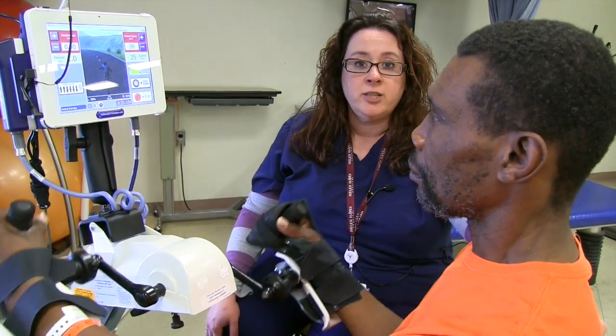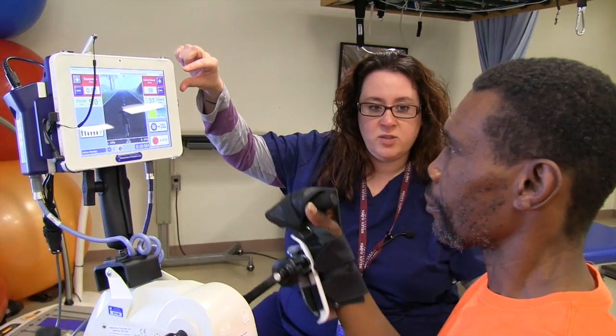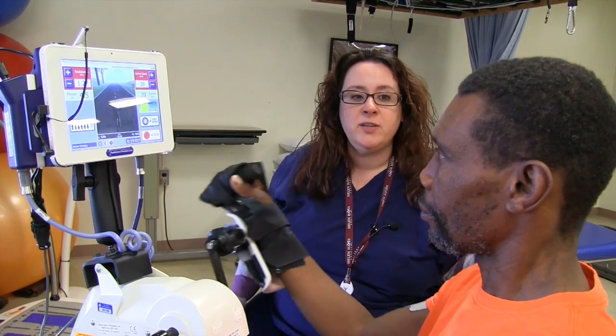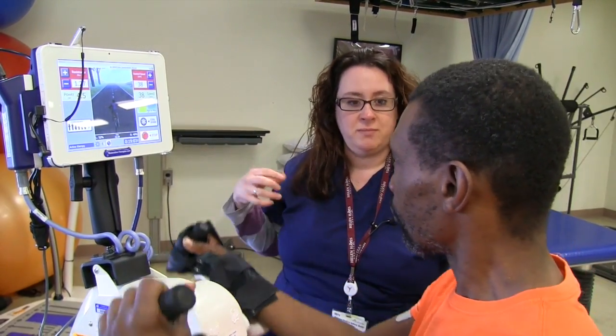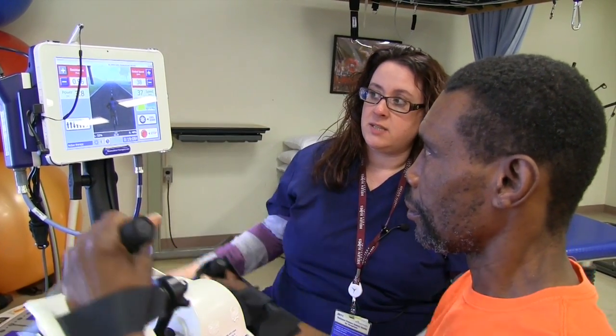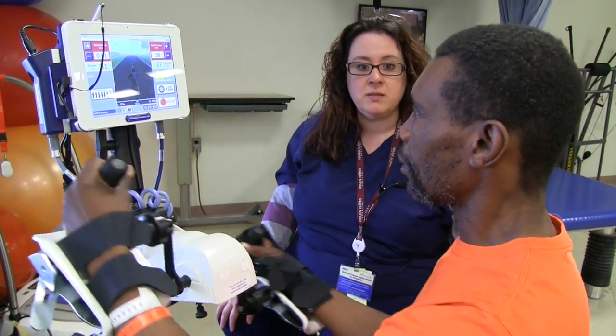So far, he's tolerating it really well. If you fall under the target speed and resistance that I've set, you'll probably feel a zing — some more e-stem — because the machine is trying to get you to those target speeds and resistance. It will actually send more electrical stem to those muscles. We use this as a form of muscle re-education, because the e-stem bypasses the brain and targets the muscle directly. But the more you move the arm, the more you retrain the brain.